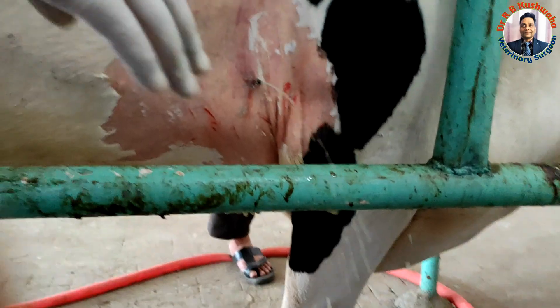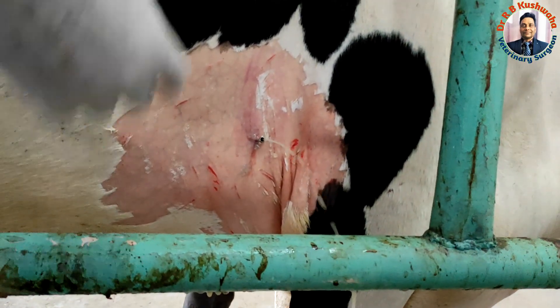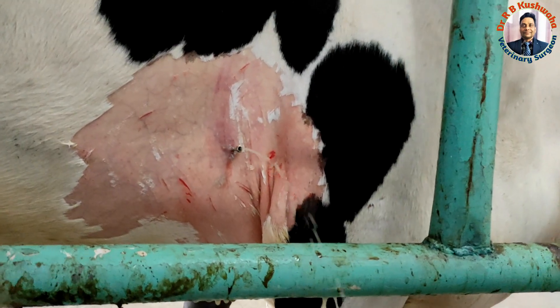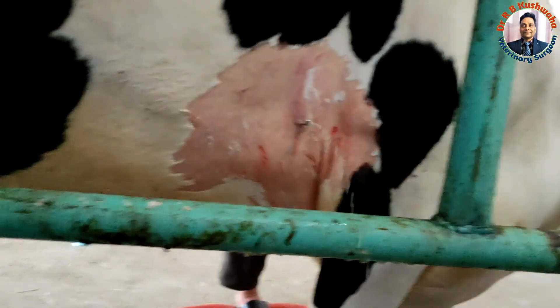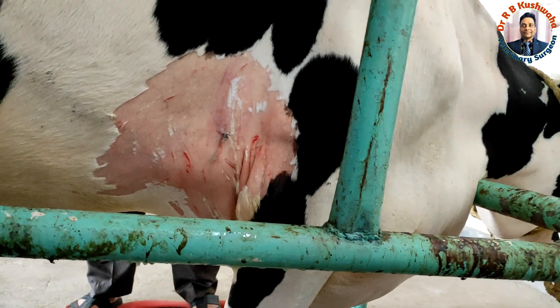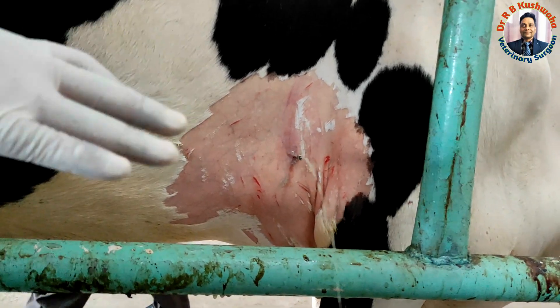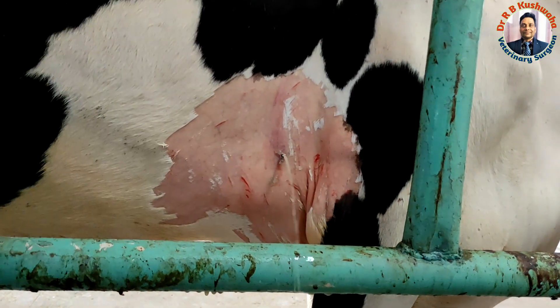For the next step, we will keep this needle inside until complete drainage is achieved. After that, we will go for rumenotomy to retrieve the foreign body — there must definitely be some foreign body. In one case, the foreign body was not visible on radiograph, but when we performed rumenotomy, the foreign body was encapsulated in the reticular wall, and by making a nick incision we retrieved it. So it is not the case that if you don't find the foreign body on radiograph, you declare it negative for traumatic reticulopericarditis. In this case, fluoroscopy was positive, so a foreign body is definitely present.